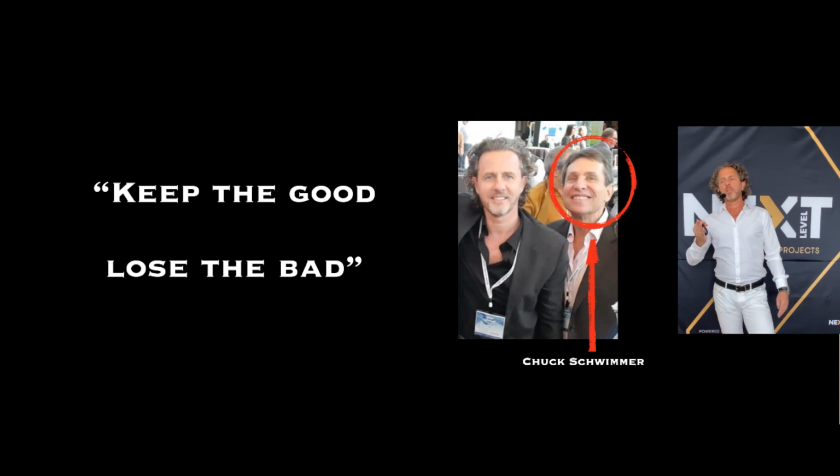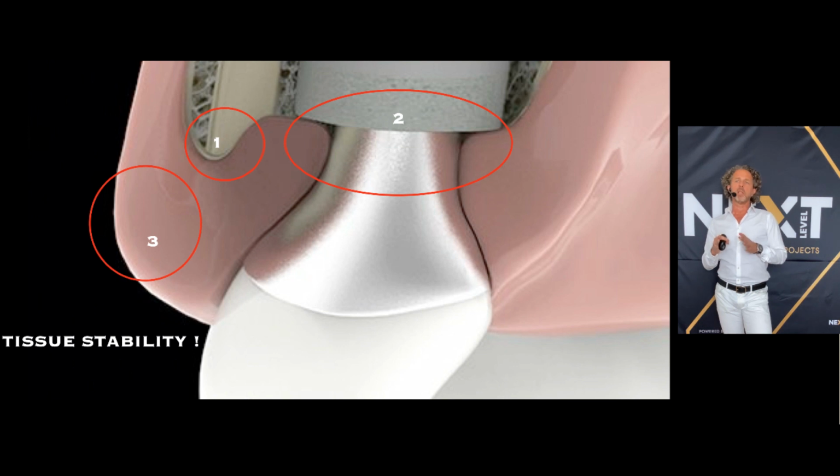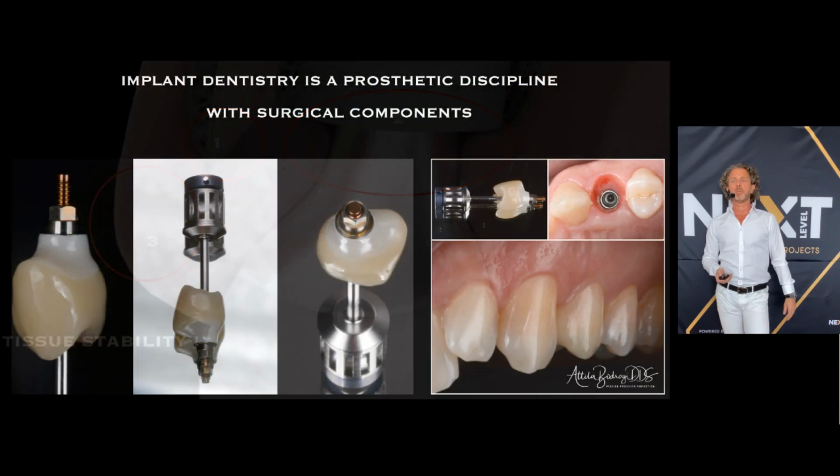So, as my good friend Chuck Schwimmer from the States announced, we should keep the good and lose only the bad portion of the tooth. So the sketch shows us those 3 elements, those 3 components, which are responsible for long-term tissue stability. And this is first of all the shield itself, then a good implant position, hopefully with a platform switching solution, and soft tissue which stabilizes the surrounding of this implant and the prosthetics.